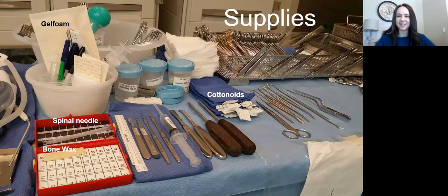After that, I will just go through this picture that I've labeled here. So this is an ACDF setup, by the way. That's got a lot of cranny instruments and it's got a lot of neuro spine instruments. So it was perfect. So you've got lots of different cottonoids here. If you see this little tray, you'll see it in my other picture. I liked to lay my cottonoids out on that. It was all very nice and neat and you could see them all. Some people just like ease of use, ease of setup and organization. So they put all the strings in the towel to hide it so you could just see the sponges on the end.